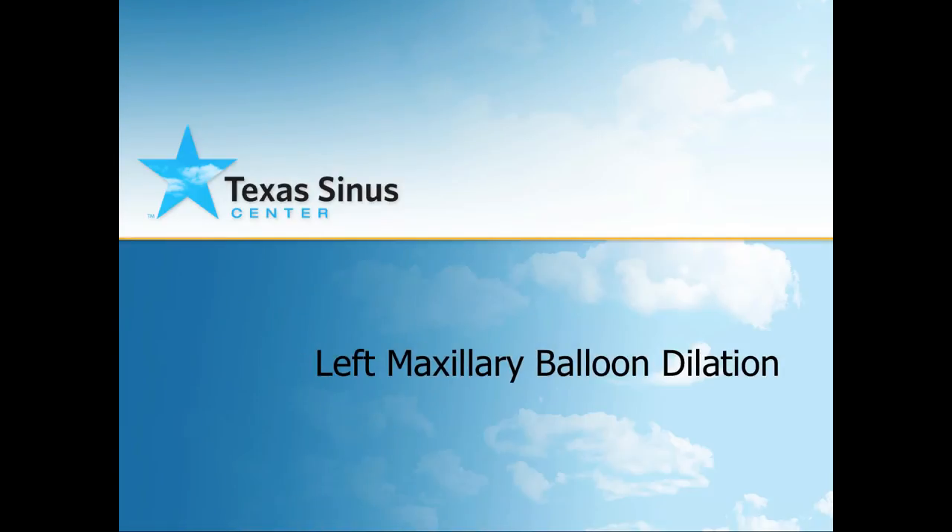This video is of a left maxillary sinus dilation using a balloon. The maxillary sinus is also known as the cheek sinus. This procedure was done in the office, not the operating room. It was done with local anesthesia and it took about 10 minutes to do both sides. I will be showing the left side dilation.